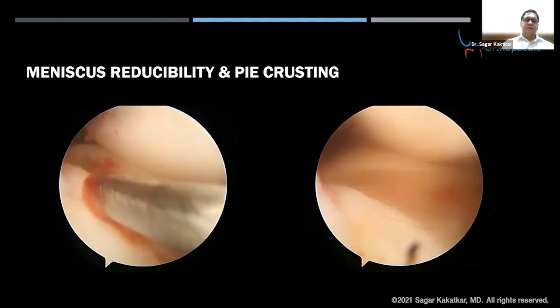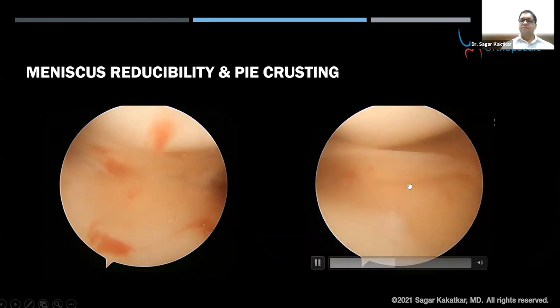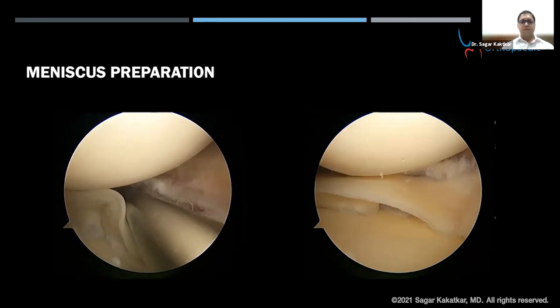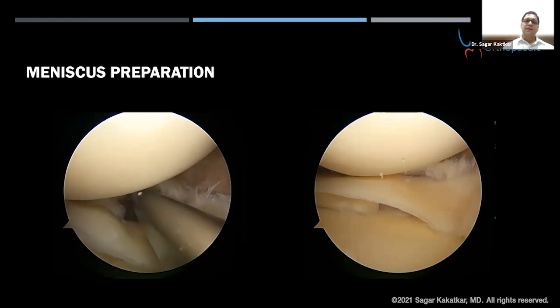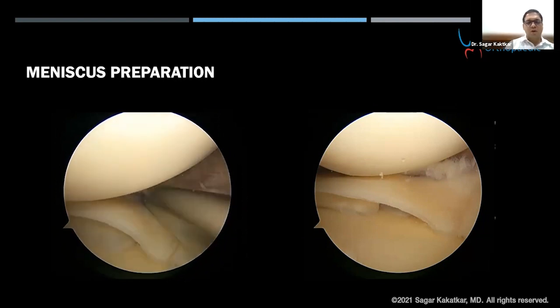I checked the meniscus reducibility — with extension, external rotation, and a valgus force applied, it could be reduced back. You can appreciate that the femoral-meniscus distance is increasing. I prefer to do it on the tibial side, though some prefer the femoral side. Proceeding with meniscus preparation, using a 3.5 shaver in a forward or pivot direction without suction on, so you don't end up shaving most of the capsular part. I take care to debride the interior capsular part, which helps in healing. I sometimes do needling with a spinal needle to increase healing, but not in this case.